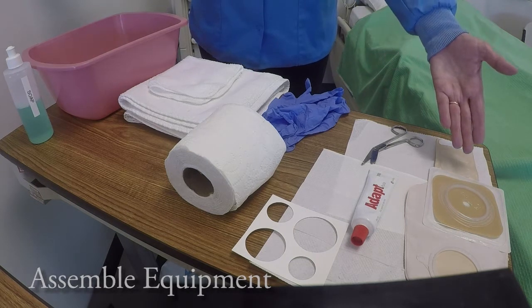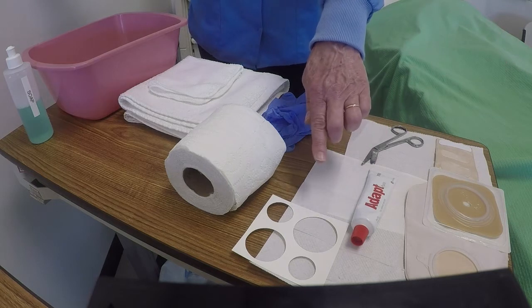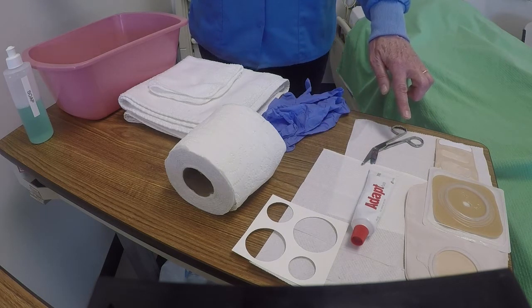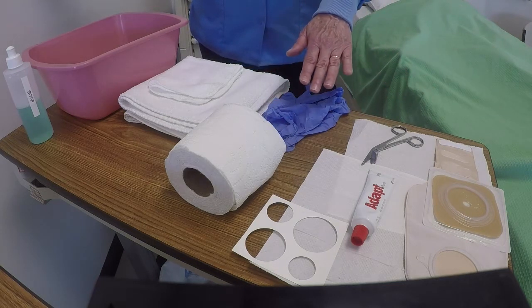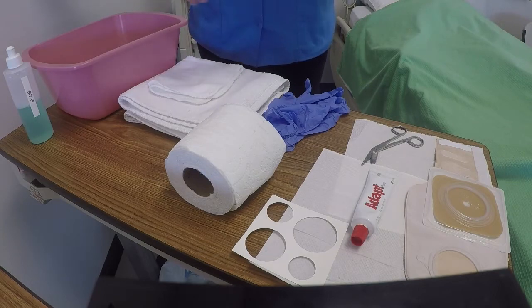We have the ostomy pouch — this is a two-piece pouch. We have the stoma measurement tool, stoma paste, scissors, absorbent material, gloves, wash basin with washcloth, towel, and soap.